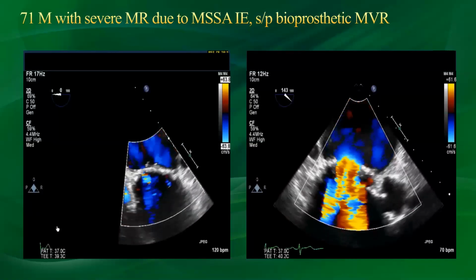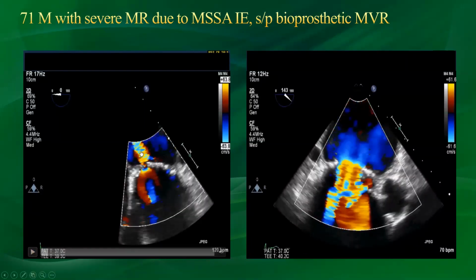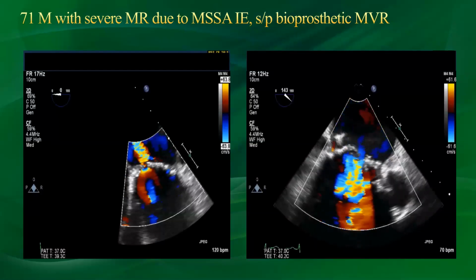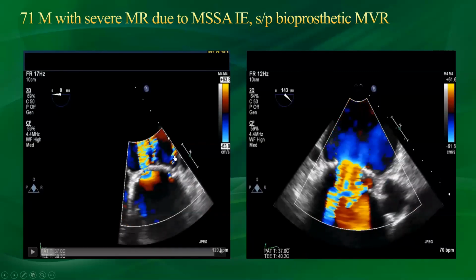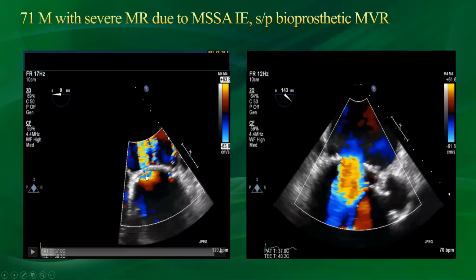Excellent. So you can see here, I'm going to stop these two images. I'm going to start again slowly here. You can see there's some flow going back here, but we're not sure if it's intravalvular or perivalvular. Remember, this is a new valve, so you shouldn't see much valvular regurgitation here. Play more, you can see some color around. There's one here at 3 o'clock, another one here, 12 o'clock, another one here. This one is not clear if it's valvular or paravalvular.